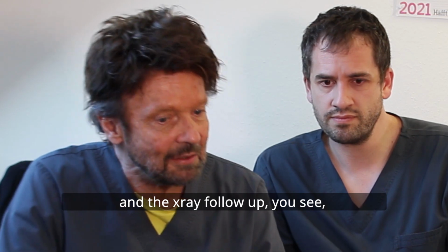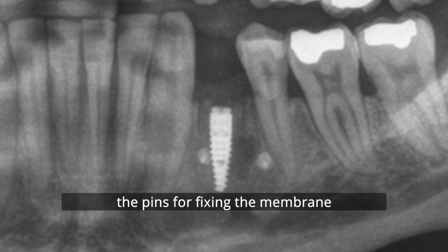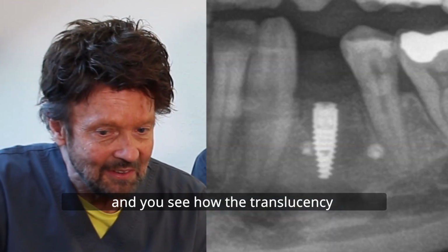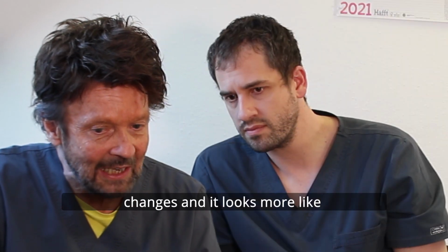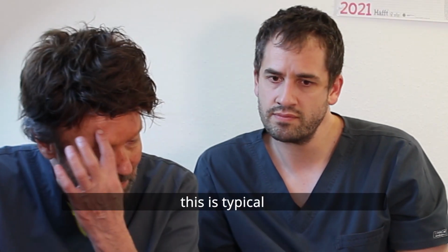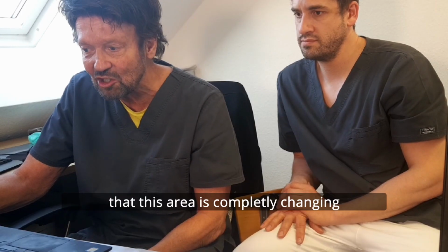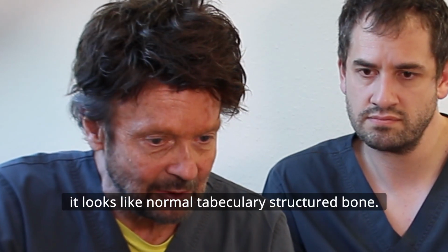And in the X-ray follow-up, you see the translucency of the ring and the pins for fixing the membrane. This is already 3 months later, and you see how the translucency is changing, and it looks more like trabecular structured bone. This is typical for the allograft ring. This area is completely changing. 6 months later, you see it looks like normal trabecular structured bone.